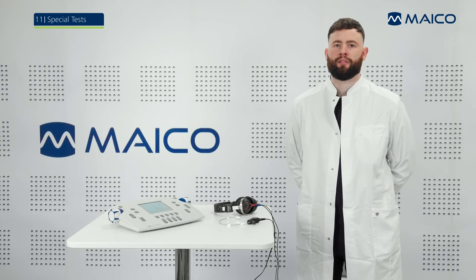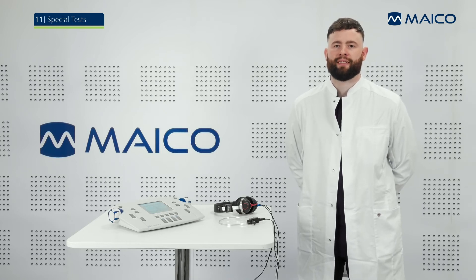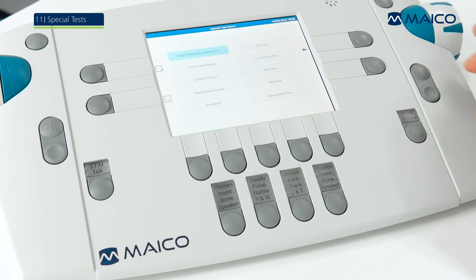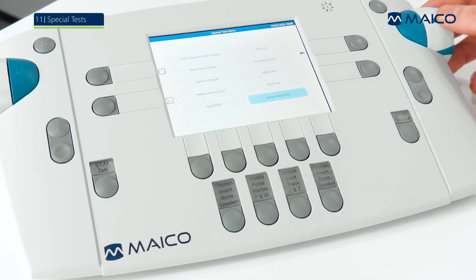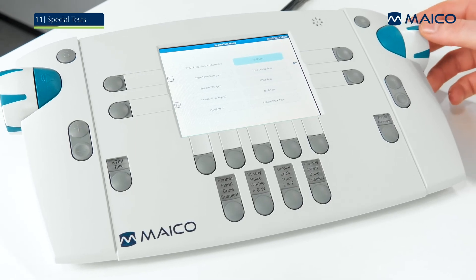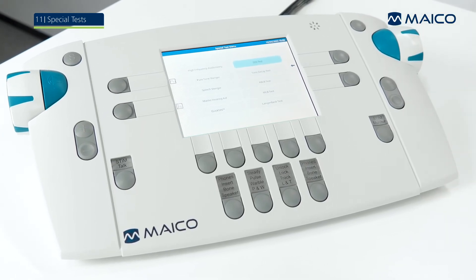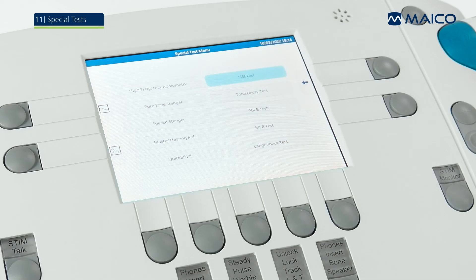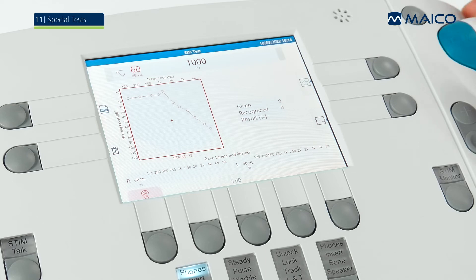As part of the special tests, the MA42 provides various over-threshold tests. These diagnostic tests include the SISI, tone decay, ABLB, MLB and Langenbeck test. The tests are used to differentiate between a cochlear and a retro-cochlear hearing disorder. All measurement screens are reduced to the necessary functions and display the pure tone audiometry measurement results of the selected ear for ease of reference.